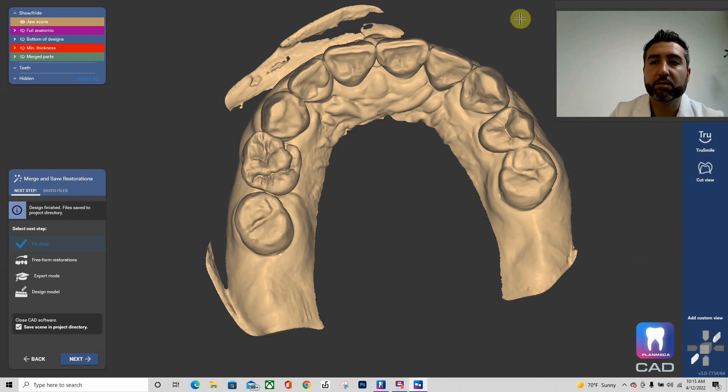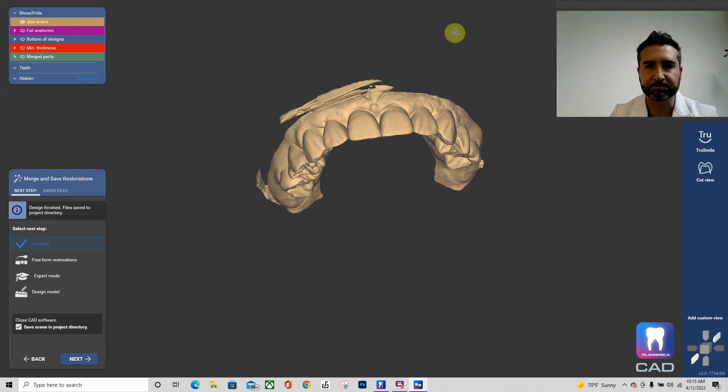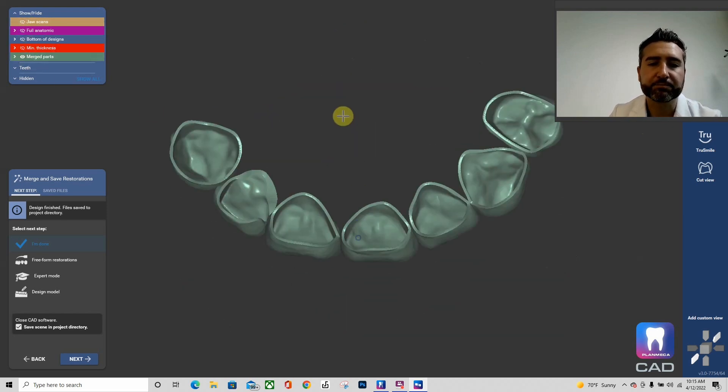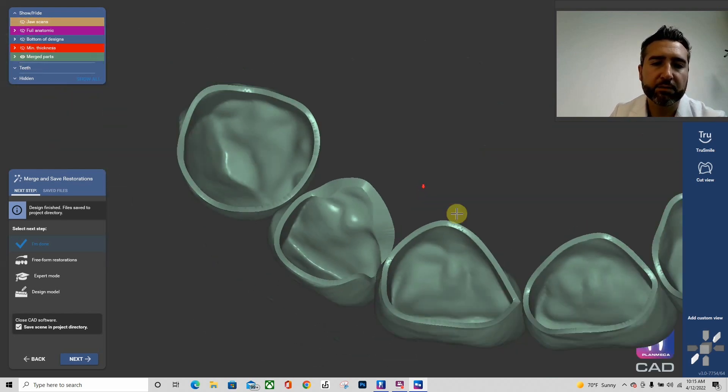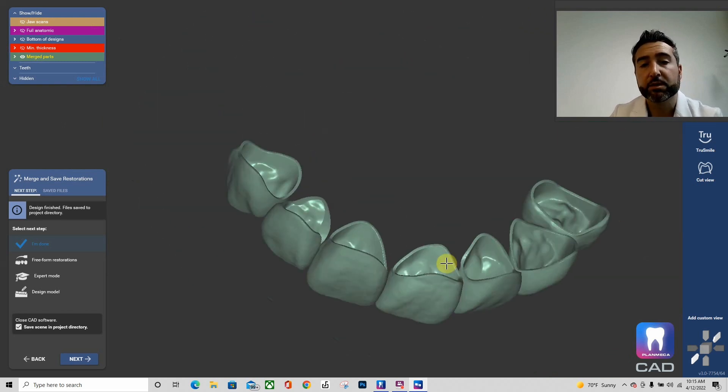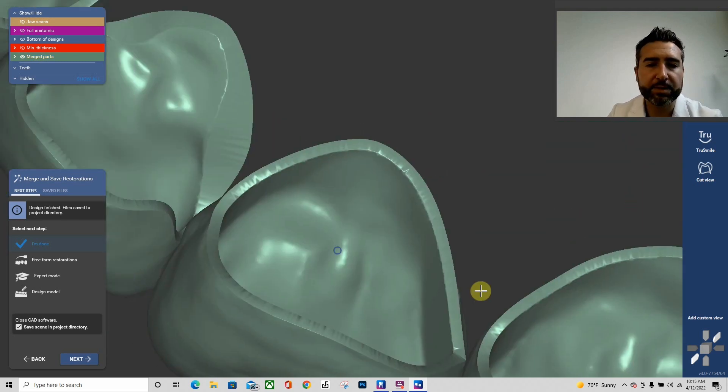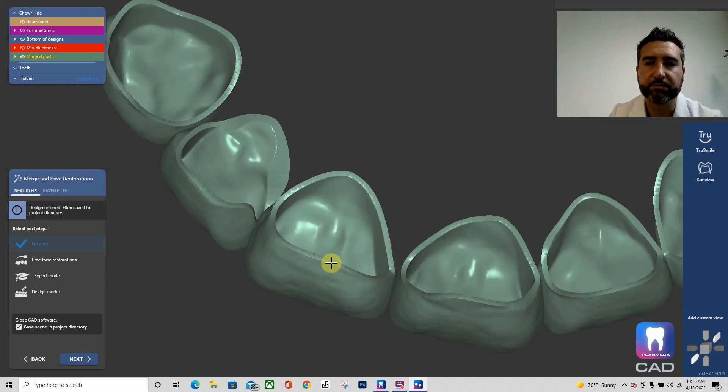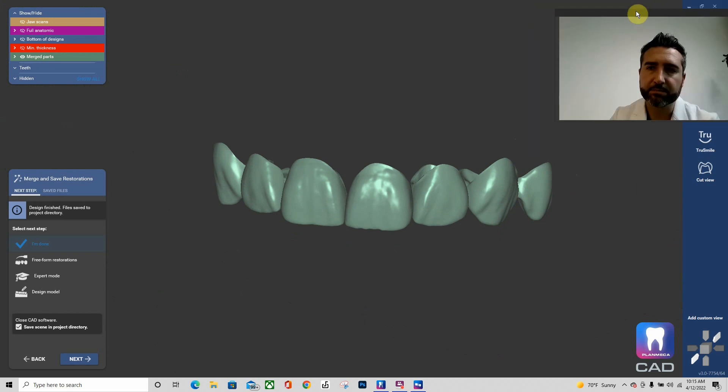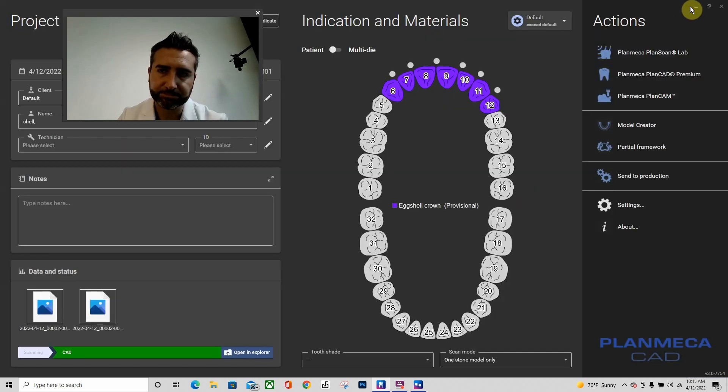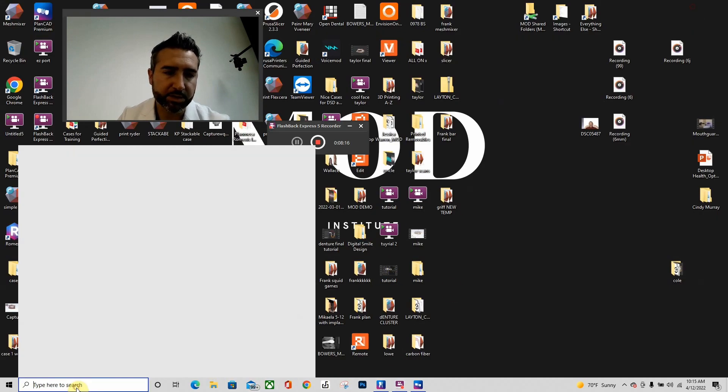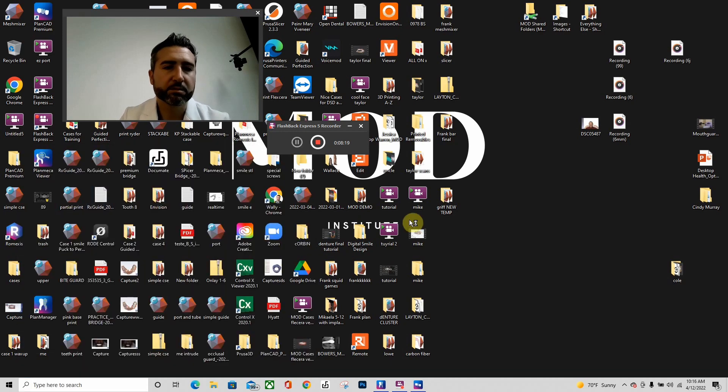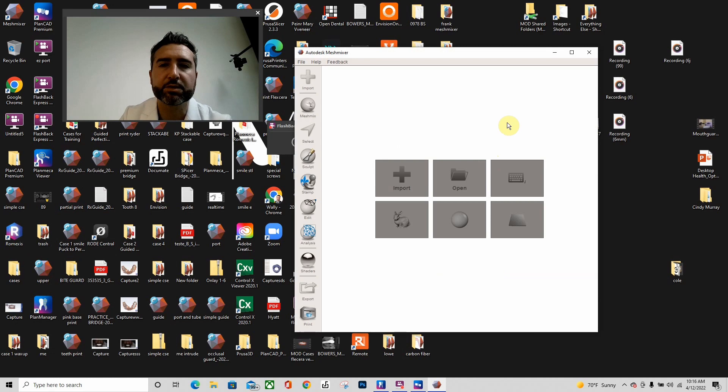Use default. So this next step is completely optional. I mean, you could get away with just printing this shell and relining it and picking it up on the day of tooth preparation. I sometimes go in with a handpiece and thin out some of these interproximal areas even further, but the best way to do this is to put a soft tissue stop. So what you want to do is open up Meshmixer. I like to do it in Meshmixer because it's easy for me, but you could do it in Exocad or whatever you want to do it in.